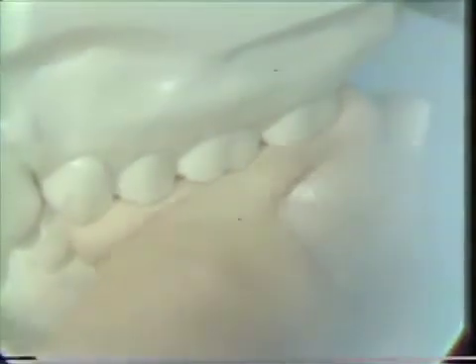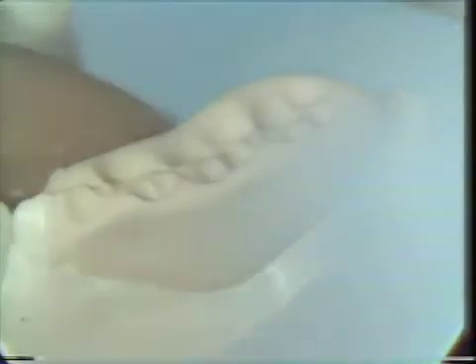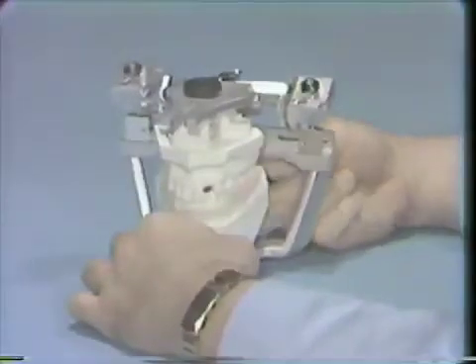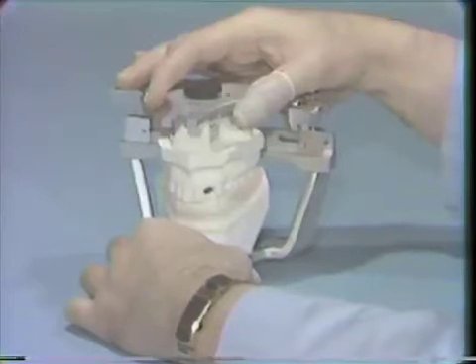And then we can mold this along the buccal surface, have the patient open, and mold it a little better on the tongue side. And again, we will take necessary precautions so that damage is not done to the teeth as the material polymerizes.